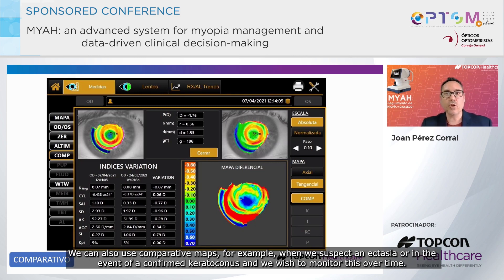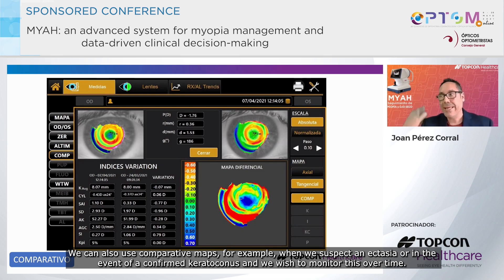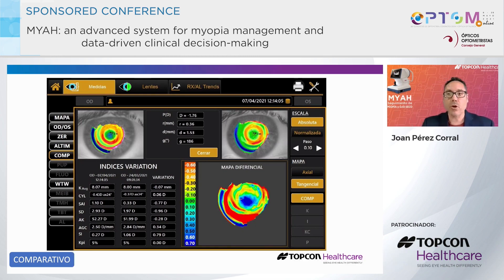We can also use comparative maps, for example, when we suspect an ectasia or in the event of a confirmed keratoconus and we wish to monitor this over time.